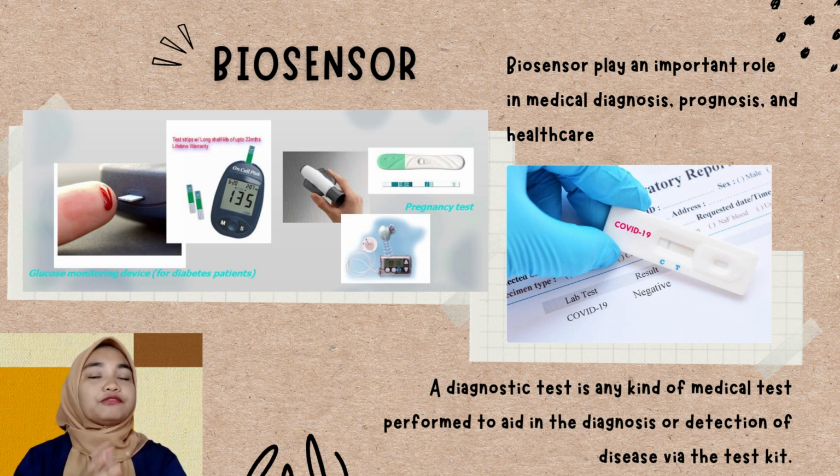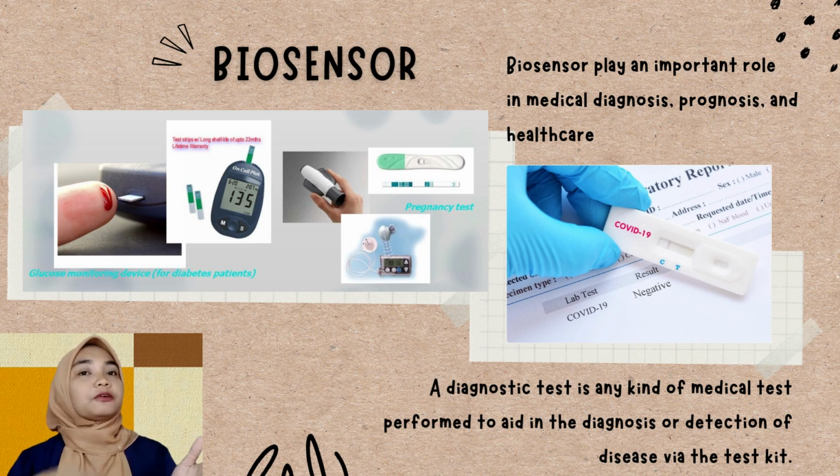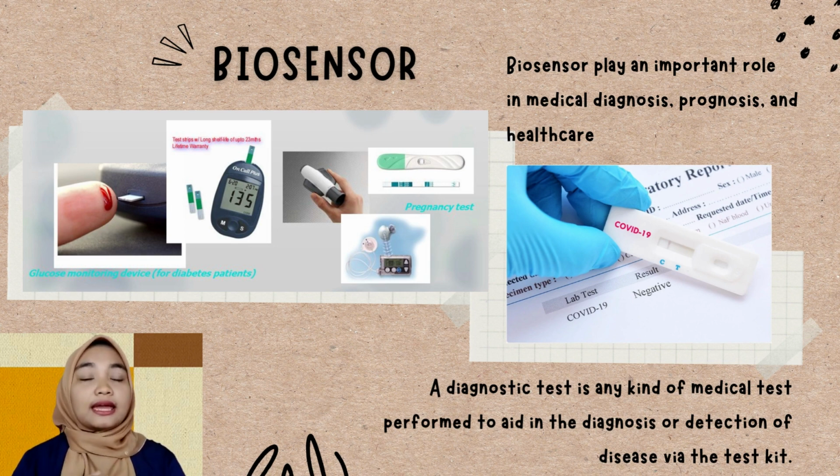Biosensors have practical significance because of their outstanding properties in terms of flexibility, portability, and high efficiency, which provide great convenience for users and play an important role in medical diagnosis, prognosis, and healthcare. In this study, colorimetric biosensors are one of the types usually used in diagnostic tests as the route of detection for antigen. They function to quantify analytes by detecting color changes that are visible to the naked eye.